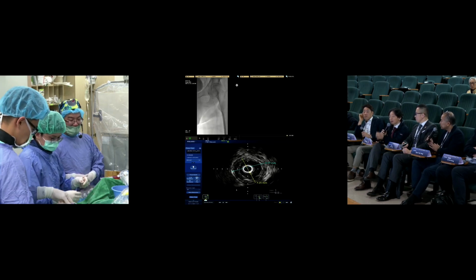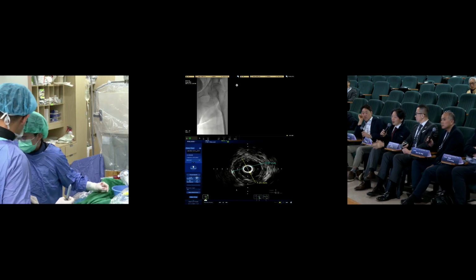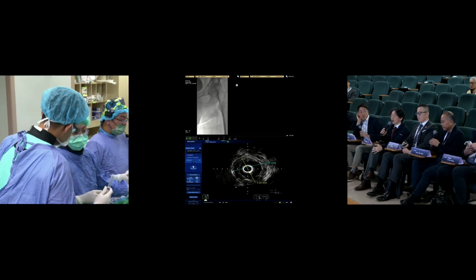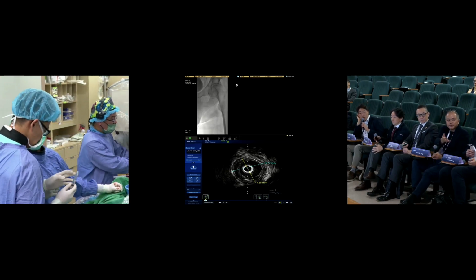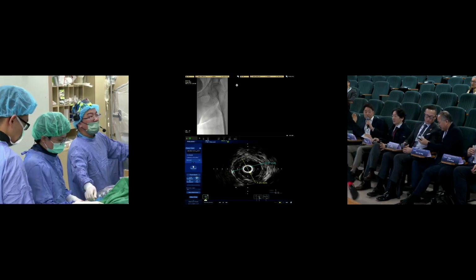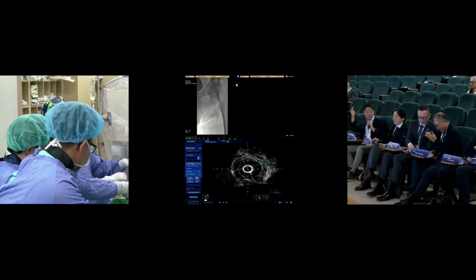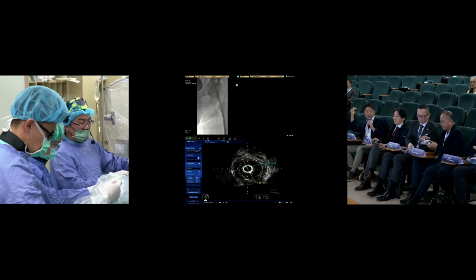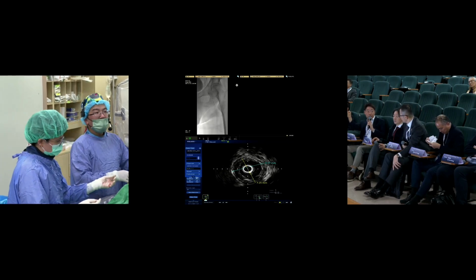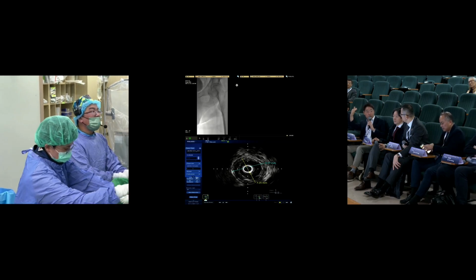A little bit the guide wire enters into the subintimal, then goes back to the true lumen in the common femoral artery. I think one thing I would like to ask the panel is, you can see the ostium is very proximal and we've come through the subintimal near the ostium. So if we place the stent to cover the ostium, it's most likely to cover the deep profunda in this patient. Would you be comfortable to stent over the profunda in this kind of case?